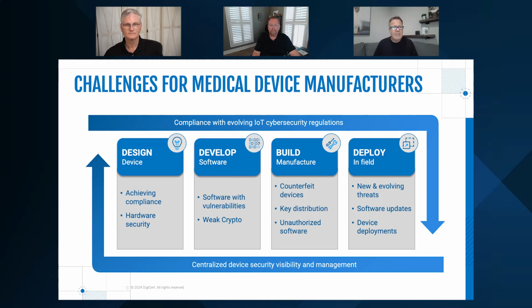And they've had a lot of challenges with vulnerabilities in crypto and new crypto standards coming out from NIST to combat post quantum computing. And so, in the develop phase, they've had to think through a lot of challenges because of these extended lifespans, right? So their medical devices may be sitting in the supply chain for 2 or 3 years and may come up in a world where post quantum computers have now broken classical algorithms. And so they need to protect themselves against that.